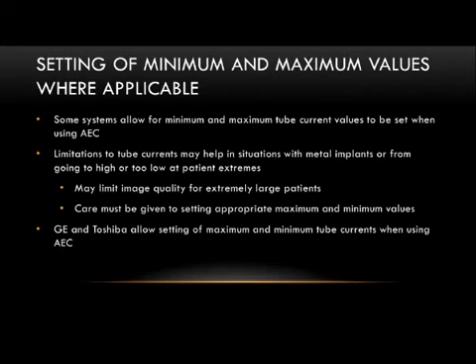But actually, for the thin patients, the image quality was not good. Same noise index, but for some reason with the smaller patients, it didn't work quite the same. And by bringing down that minimum tube current, we actually made it even worse. A lot of them would have minned out. Instead, we brought it lower, and they were approaching non-diagnostic, so we bumped it back up.